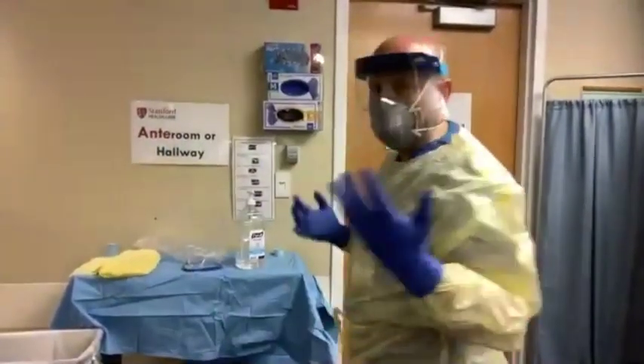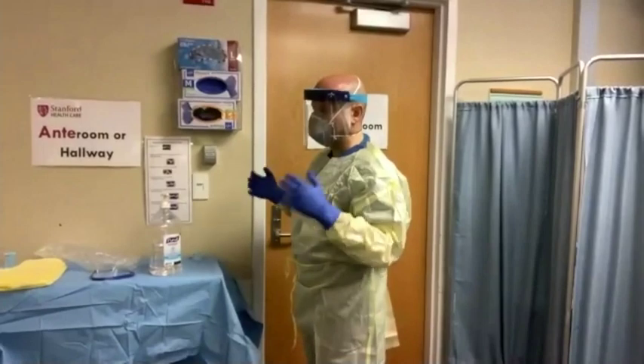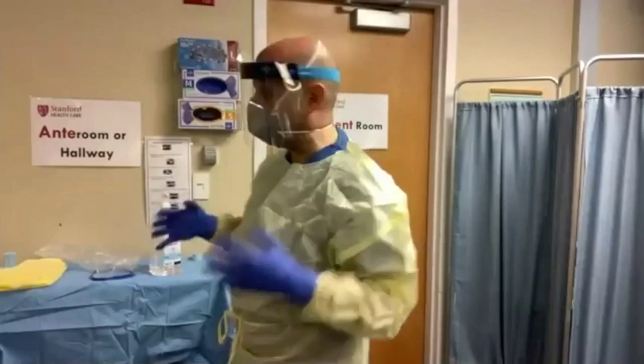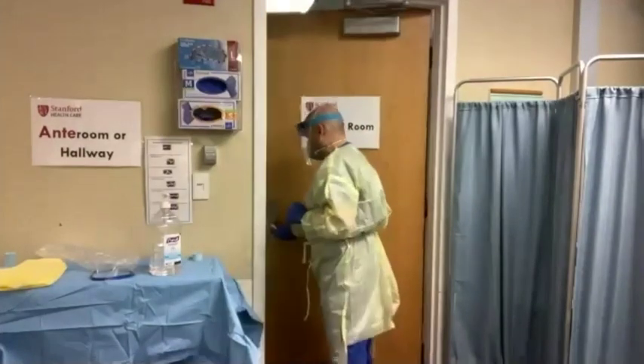So now I'm ready to go to the patient room. This is the anteroom, as Dr. Knowlton mentioned, or the hallway. Some isolation rooms have an anteroom and some do not. Carleen Mills will talk to us more about that after we finish this demonstration. So I go to the patient room.